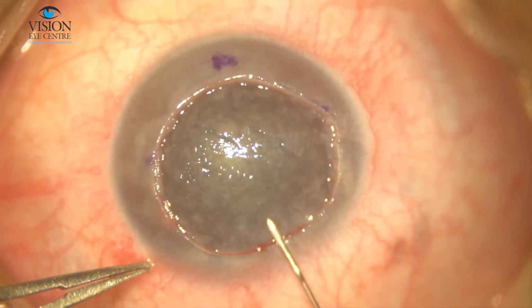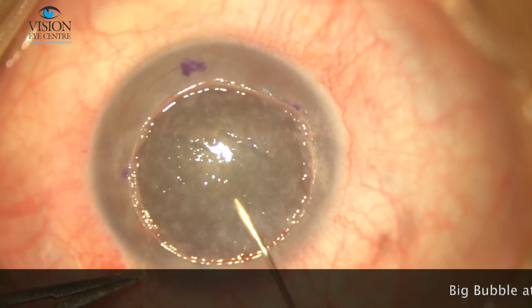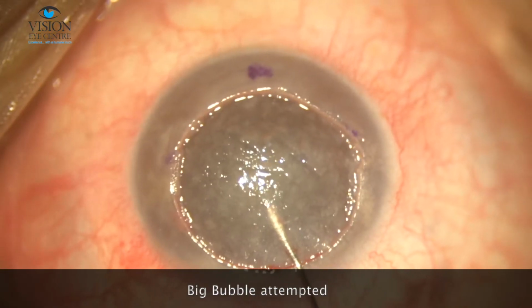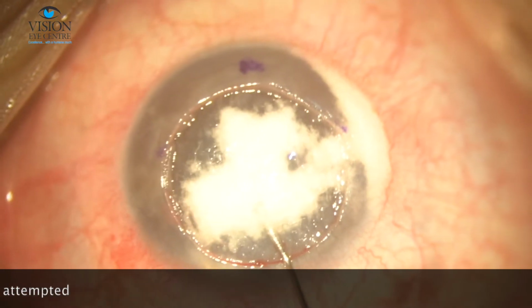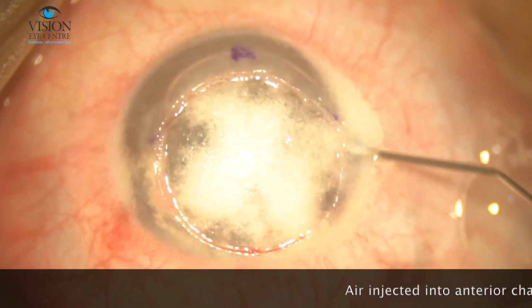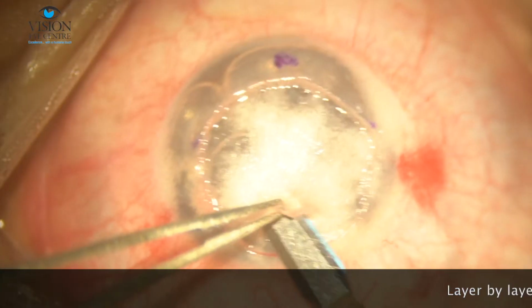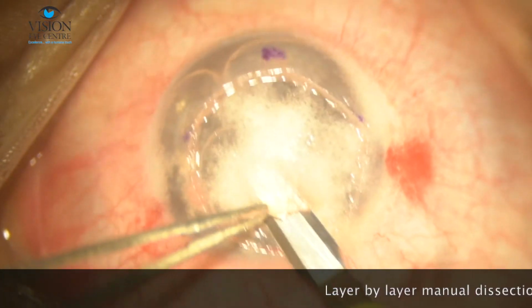So in this case, the Anwar's air bubble technique was attempted as well. We used a 30 gauge needle to get into the posterior stroma and then attempted the bubble. However, what you see here is the emphysema that develops in the stromal layers, and that actually helps us go on with our manual dissection further on.